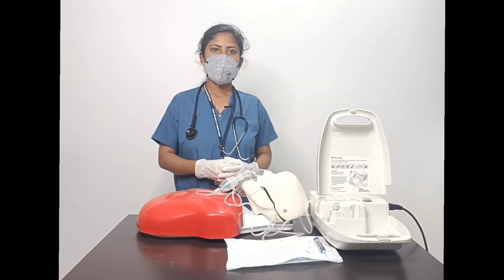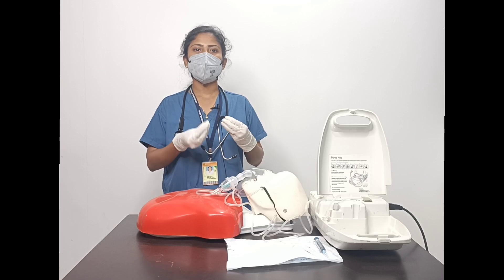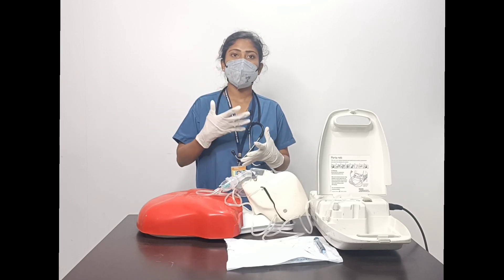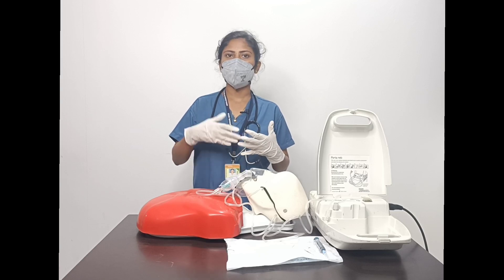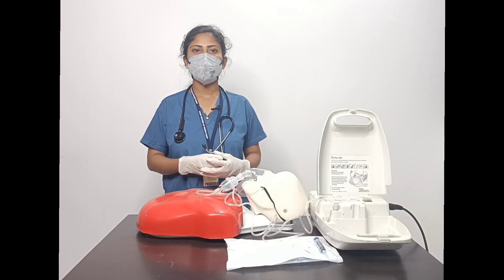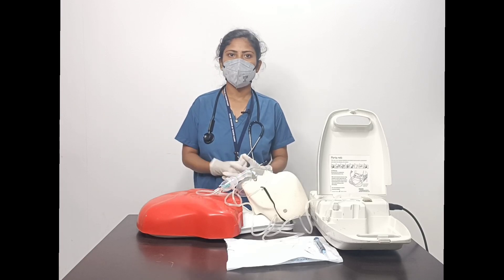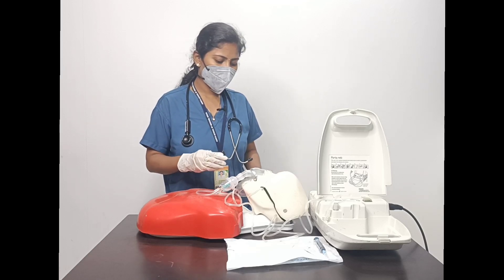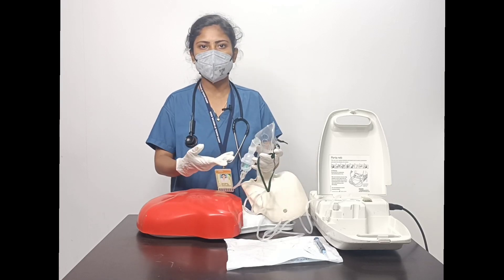Confirm that the patient is comfortable with the nebulization. After completing the nebulization, secretions inside the respiratory tract will thin out and the patient will start to cough out sputum. If necessary, provide a sputum mug or disposable tissues to the patient.